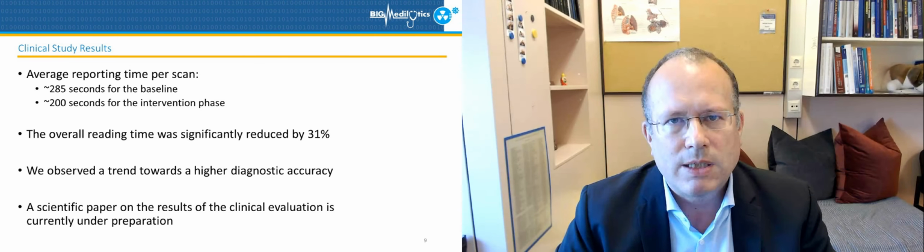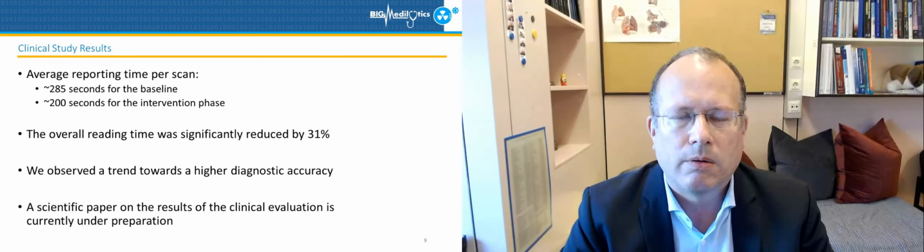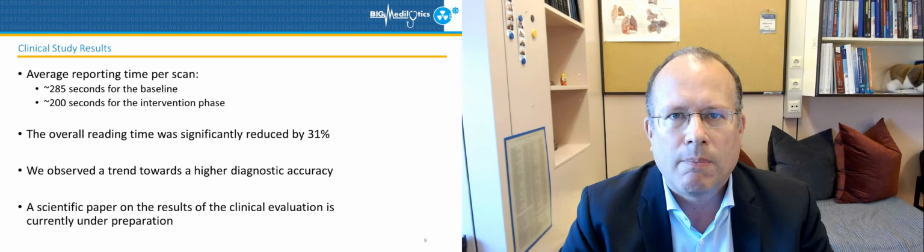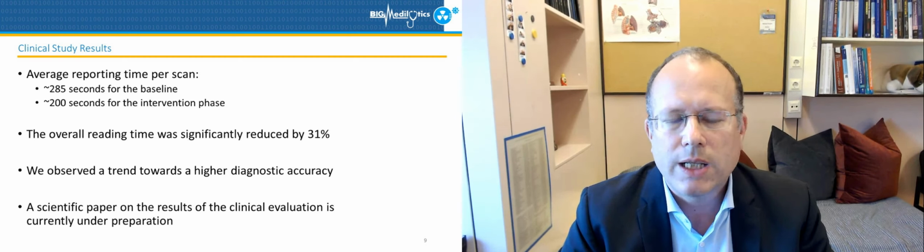But if you have the search engine at your hand, your reading process is sped up, because you are quickly referenced to relevant information, and you don't have to think too much and too long about the diagnosis or differential diagnosis. You get specific information about the diagnosis you are about to make. So the overall reading time was reduced by 31%.